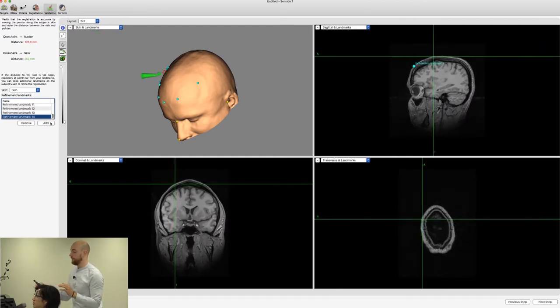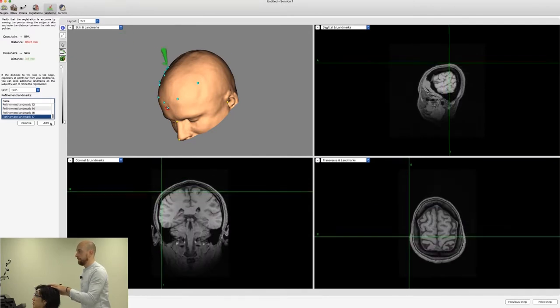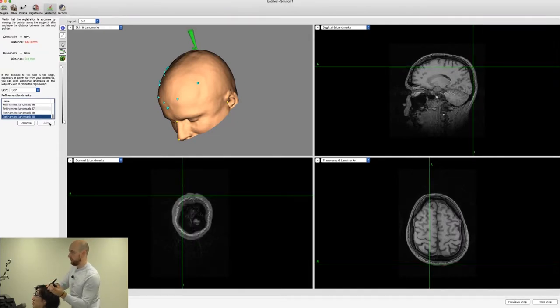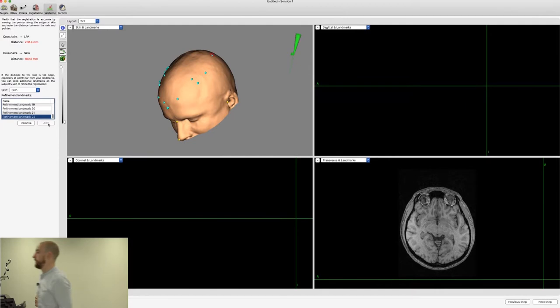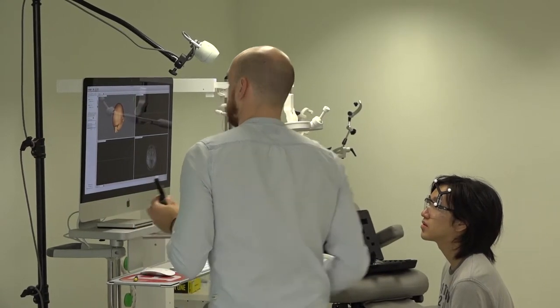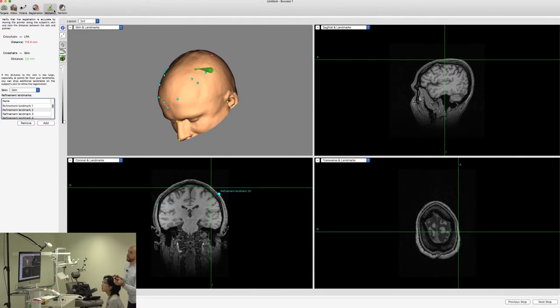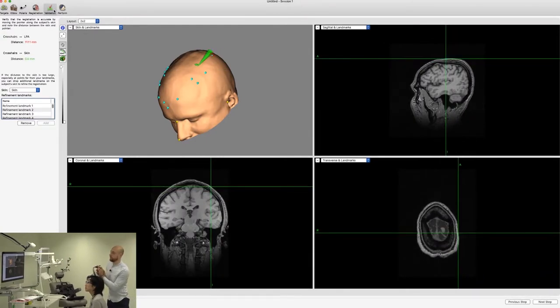Okay, so keep clicking, and then we've got the front of the head there. That's good. Okay. So we should see on this one here, we've got some refinement landmarks there. So now we should see when we do this those numbers there. You can see the bottom one there, the crosshairs, the skin, we're in the green, which is good. That's exactly where we want to be. So we're green all the way around the head, across those poles of the head.